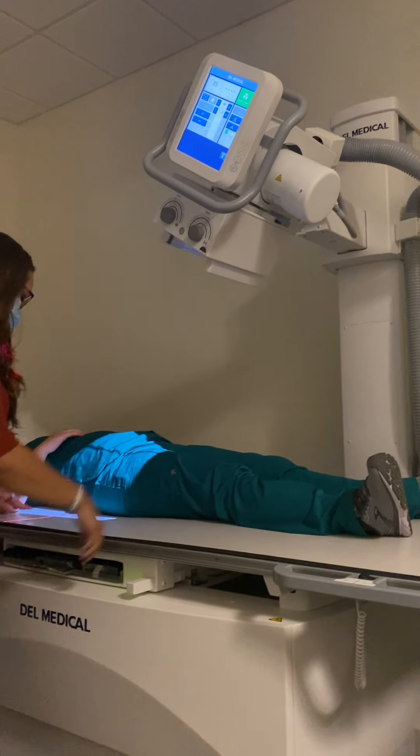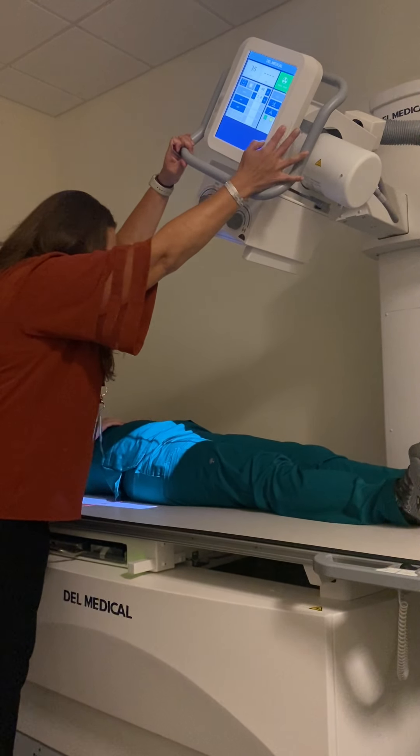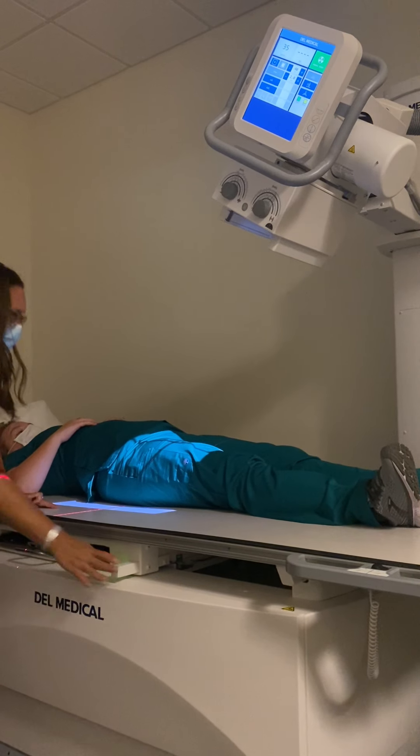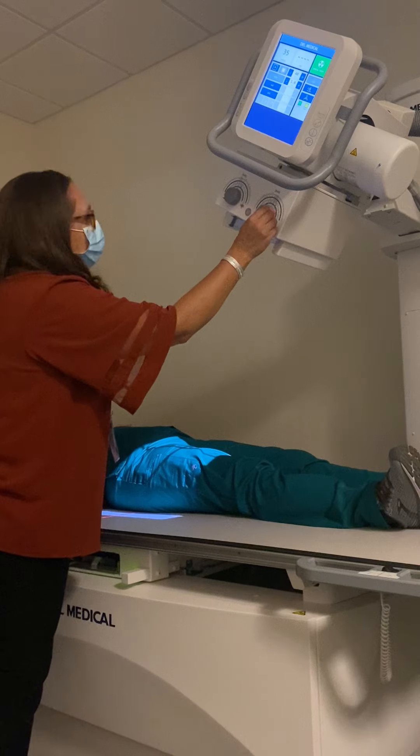I'm going to re-line my tube and bucky, and I'm going to collimate to a 10 by 12 lengthwise.